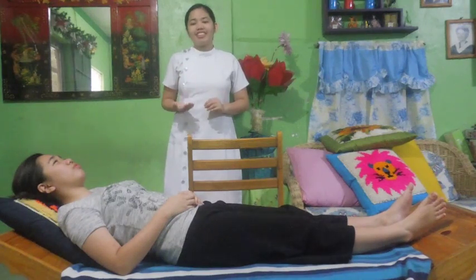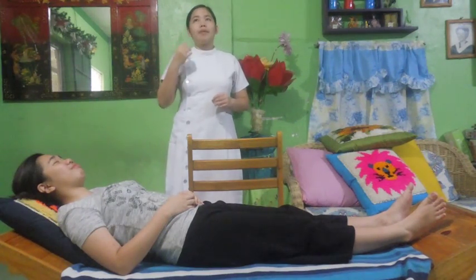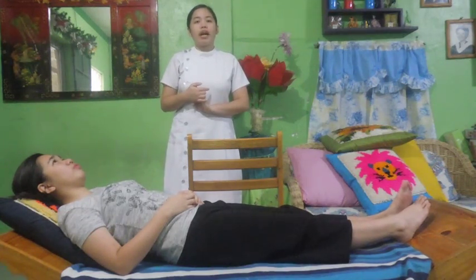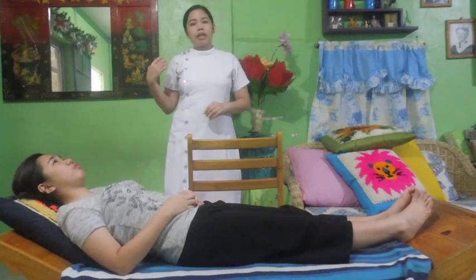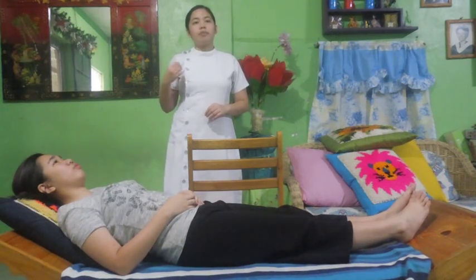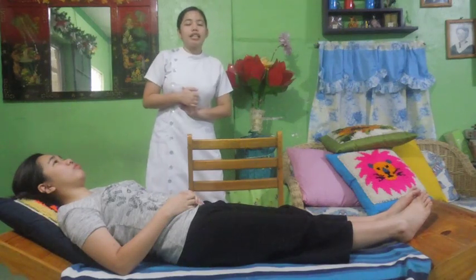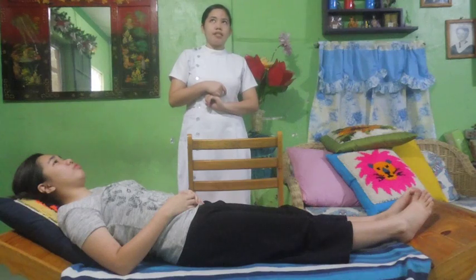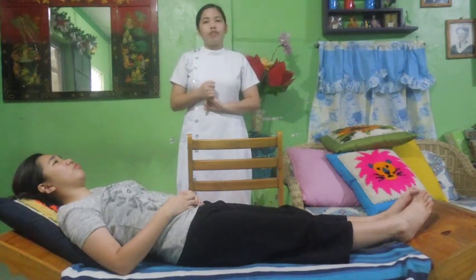Also consider the hindrance when moving the patient, like IV, heavy cast, or other contraptions, and other assistance from healthcare members or healthcare providers, and the functionality and availability of the supply like headboard trapeze, sliding sheet, friction reducing device, or other device that is required.